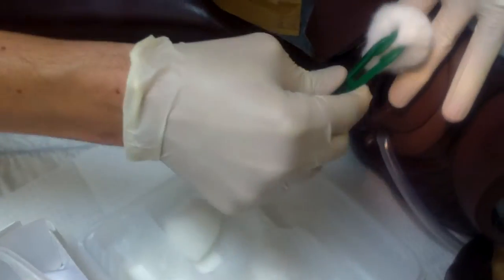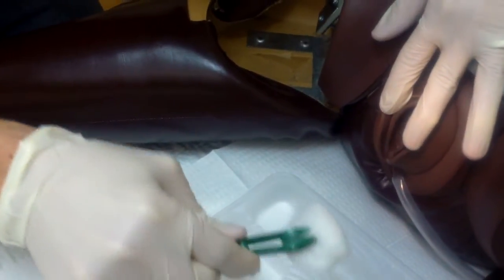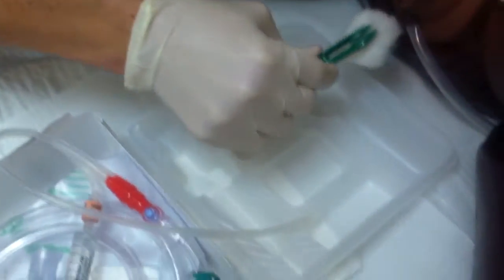I'm gonna use up all my cotton balls, going from the top down, front to back, and go right down to the meatus. And also try to relocate that from the pericare. Just make sure you get it really good and clean, and then go straight down. Okay, and that's all done.